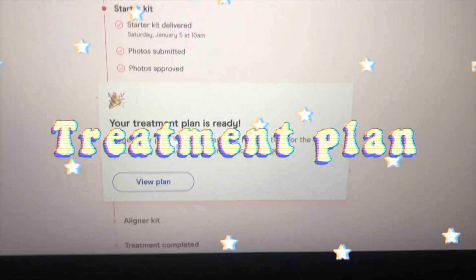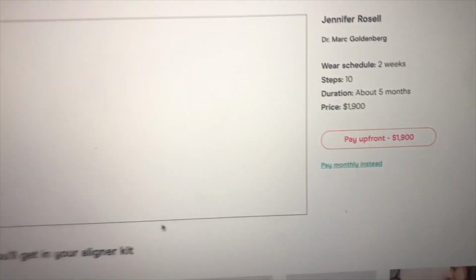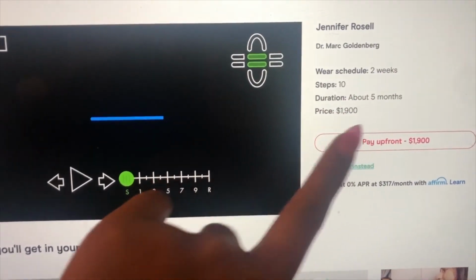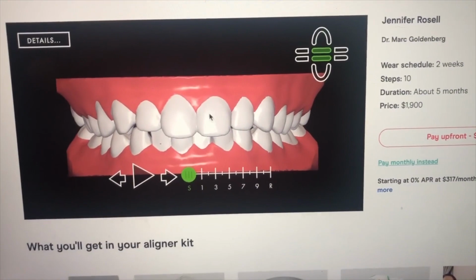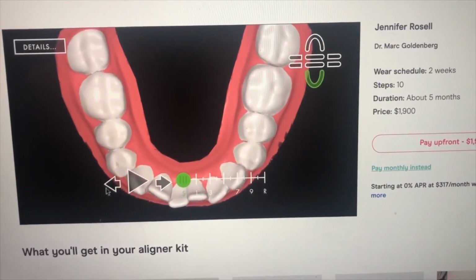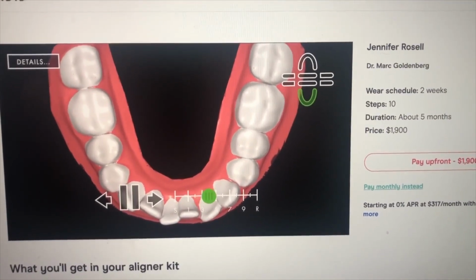The back end looks like it shows everything that you've done. So we're gonna view my plan. I'm excited. Wear schedule 2 weeks, 10 steps, about 5 months. This is the price, which is not bad. Here we're gonna see how my teeth are. Let's see, my bottom teeth are really bad. So these are my bottom teeth. Let's play this. Oh wow.